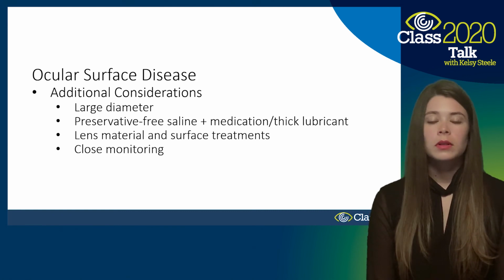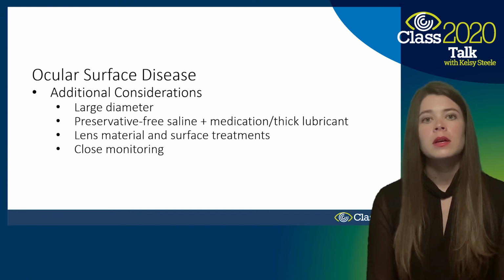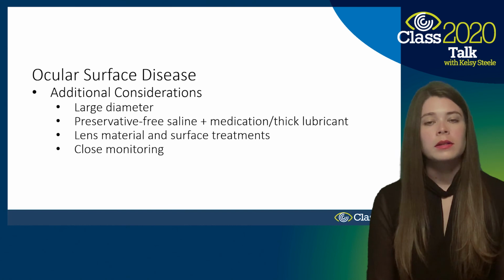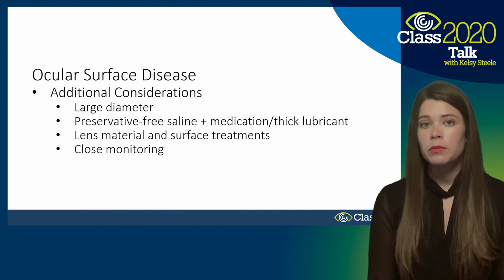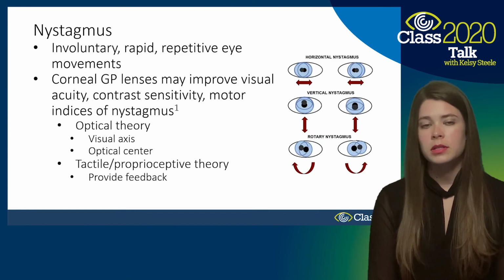And then, like I said, really close monitoring, because these patients who have corneas that are all torn up and already angry and inflamed, you don't want to just let them go for a while, especially if you're having them wear it therapeutically. You want to be following them pretty closely to make sure they don't have an opportunistic infection.